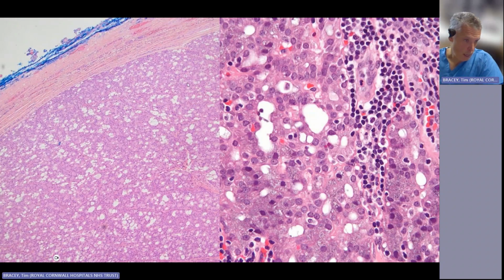On the other hand, you can see here these nice zymogen granules on the H&E would be highlighted nicely on a PAS if you did that. They often have quite a dense lymphoid cuff. This one doesn't here on the left. Ones with the lymphoid cuff tend to have a better prognosis. So if you see a lymphoid cuff on an acinic cell carcinoma excision, then mention it.